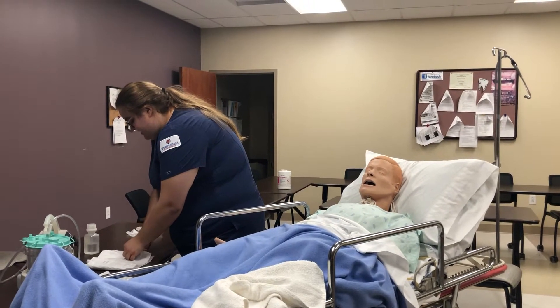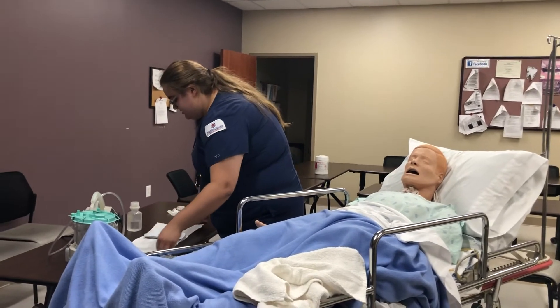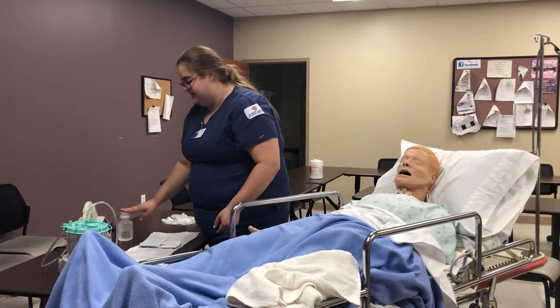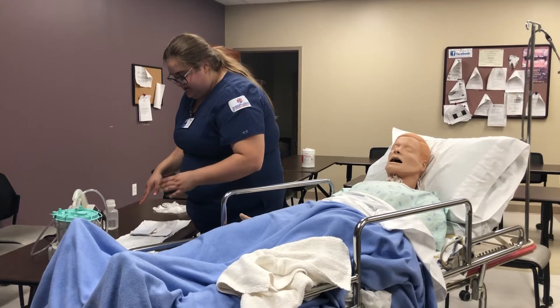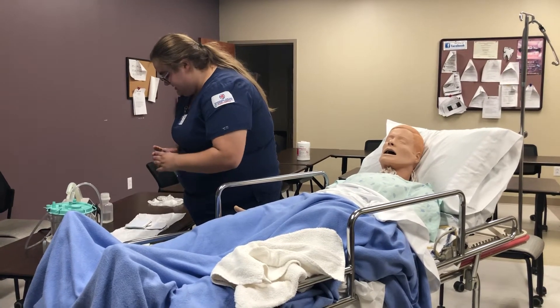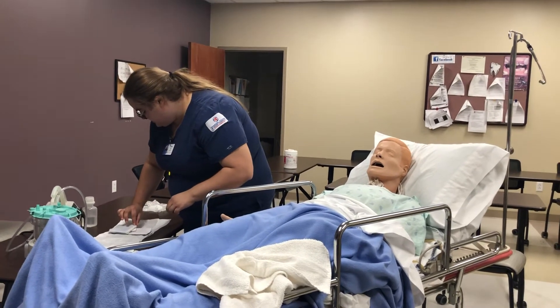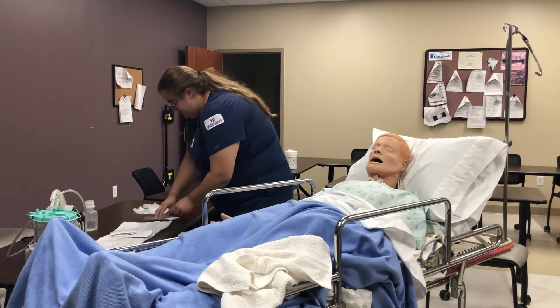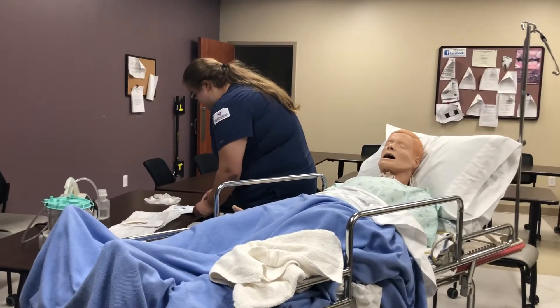You want to open the kit and be careful not to contaminate what's on the inside. This trach kit contains everything we need except for the normal saline. It has our gloves, our little saline collector, and our suction. I will put on the gloves using proper sterile technique.